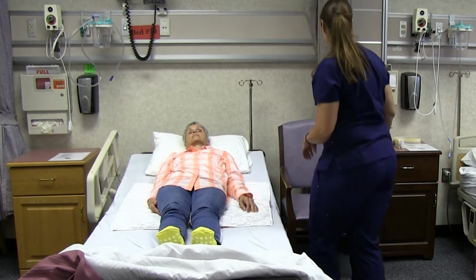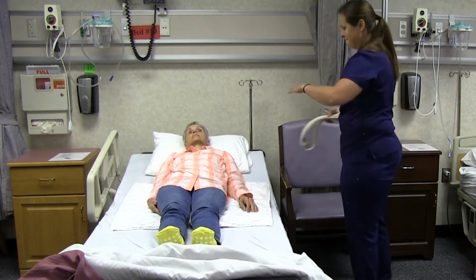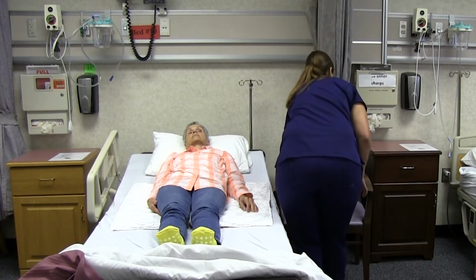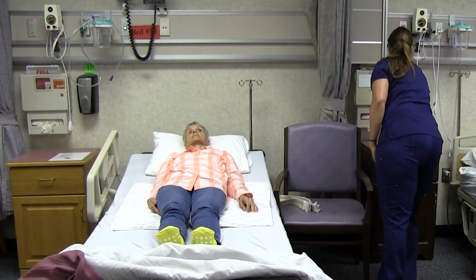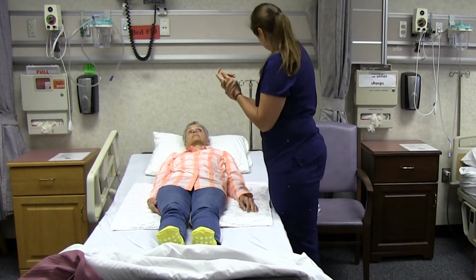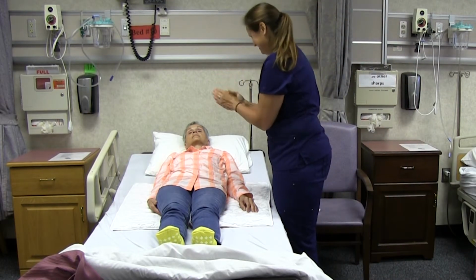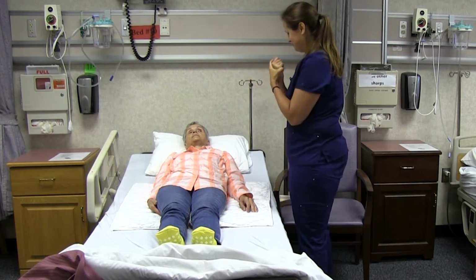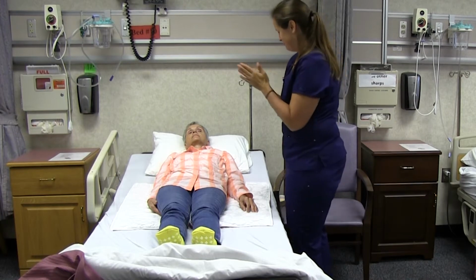Gathers appropriate equipment, gait belt, and bedside chair. Performs hand hygiene. Verifies brakes are locked. Explains procedure to client. Ensures client has on non-skid slippers or socks, and states expected outcome: client is transferred safely to chair or bed. This patient will be weak on the right side.